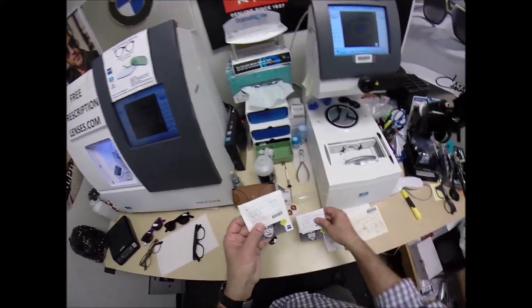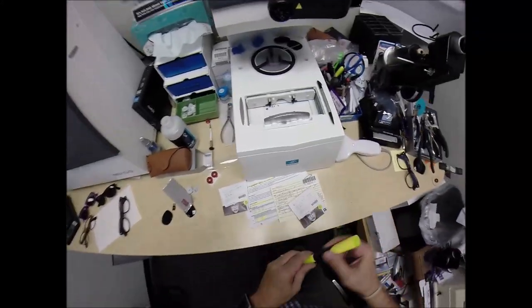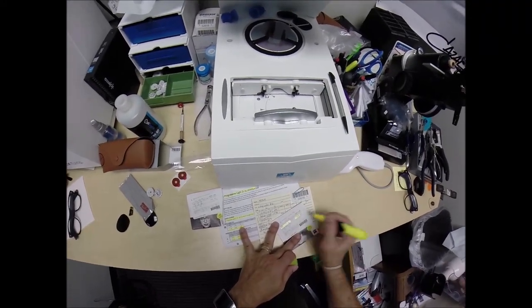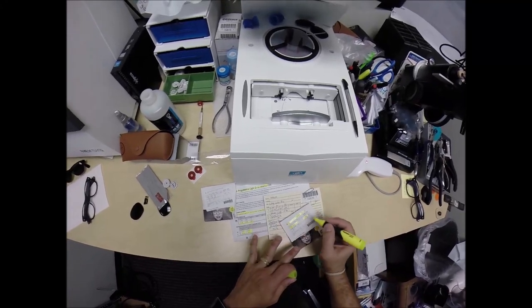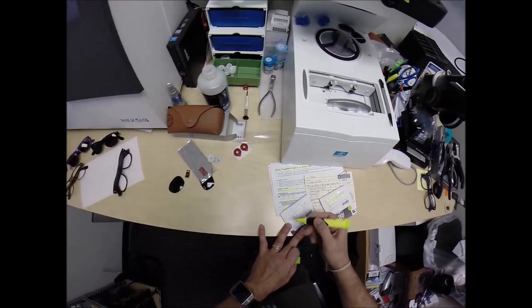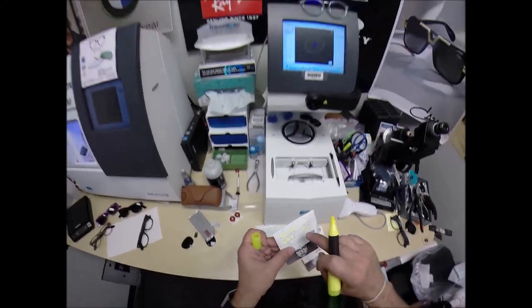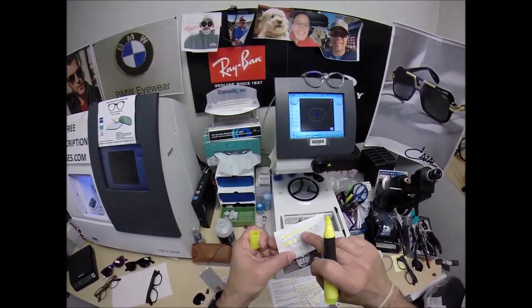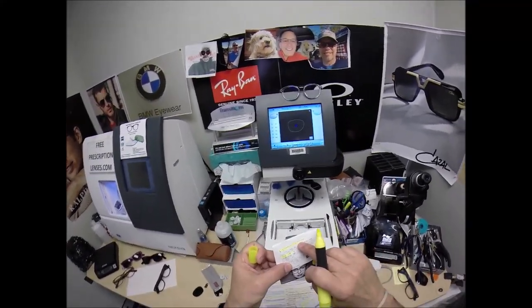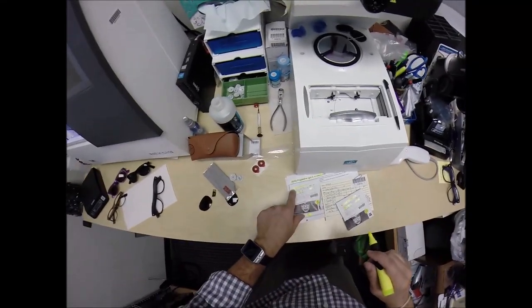You also get the same information written on the lens packets. The right lens is plus 175 minus 50, two and a quarter add. The left lens: plus 2 minus 1 at 79. The Zeiss Lite D 18, 1.59 refractive index of polycarbonate. CR 39 is 1.50, high index is 1.67. Transitions Vantage is written right there, and it's got R for the right lens and L for the left lens.